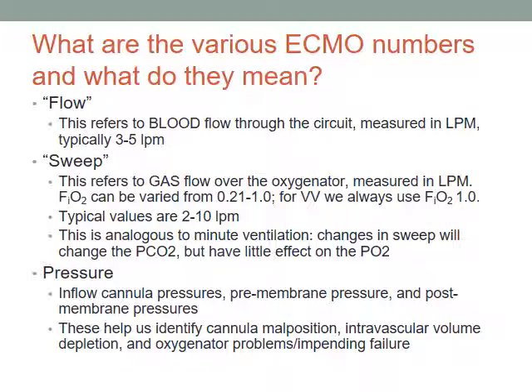We'll talk about that. There's a bunch of terms that we use in ECMO, and we thought a lot about how to name things so we don't get them confused with other parts of the circuit and other things we're doing. I've already used the word cannula. Those are the great big tubes, and we use that term to distinguish them from all the other things we put into patients. So we're talking about the ECMO cannula, the great big tubes that go in and out of the veins and arteries.